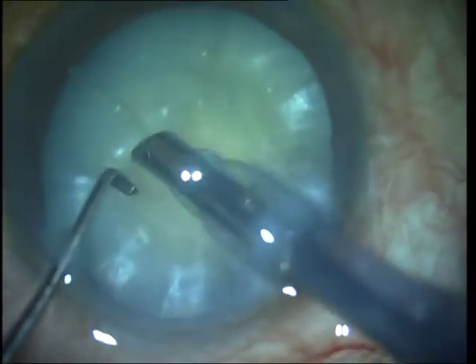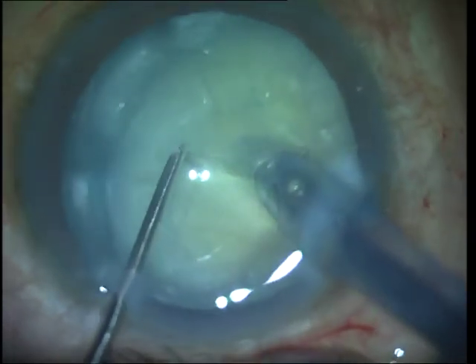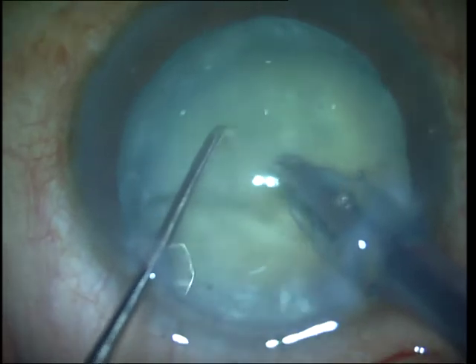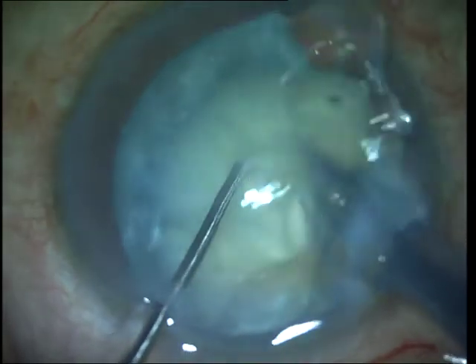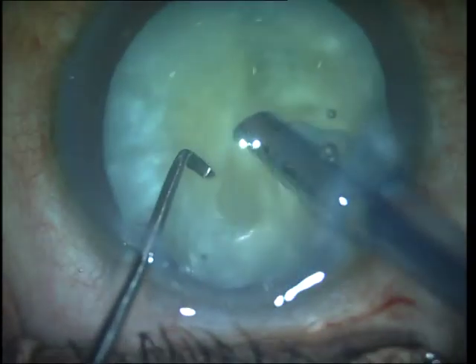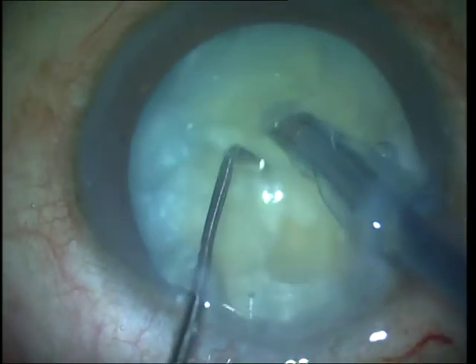As you can see, this is a long sharp pointed chopper. I embed the nucleus with the phaco tip and go directly next to the phaco tip and create a lateral separation movement, thereby performing a vertical chop. White cataracts are generally brittle and they are easy to chop, unlike hard brown cataracts which are more leathery and difficult to separate.